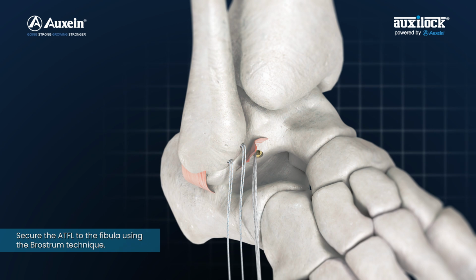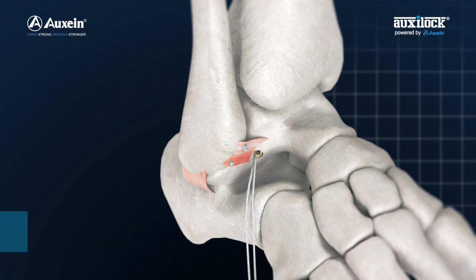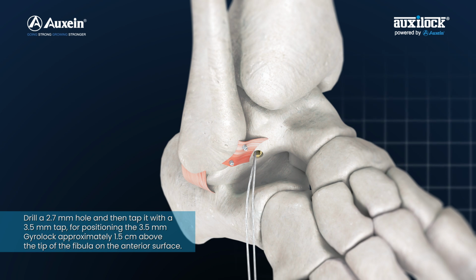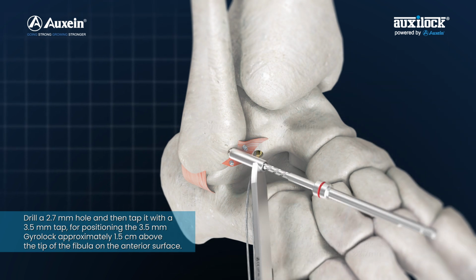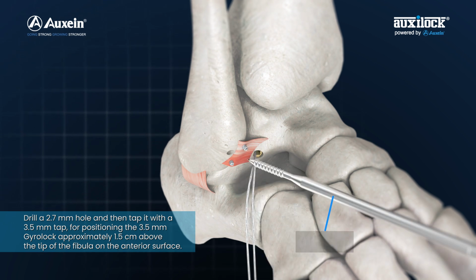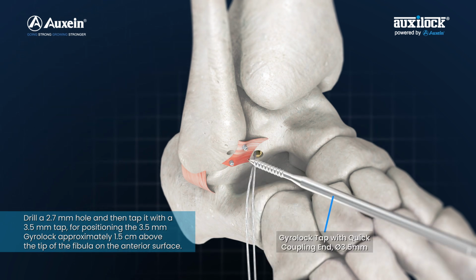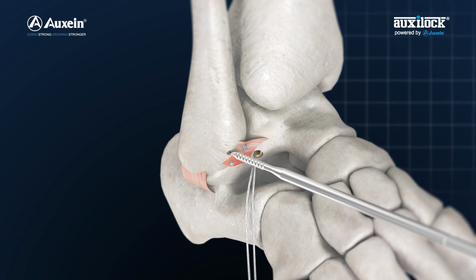Secure the ATFL to the fibula using the Brostrom technique. Drill a 2.7 mm hole and then tap it with a 3.5 mm tap, for positioning the 3.5 mm gyrolock approximately 1.5 cm above the tip of the fibula on the anterior surface.